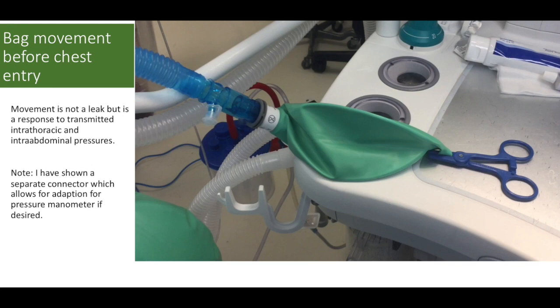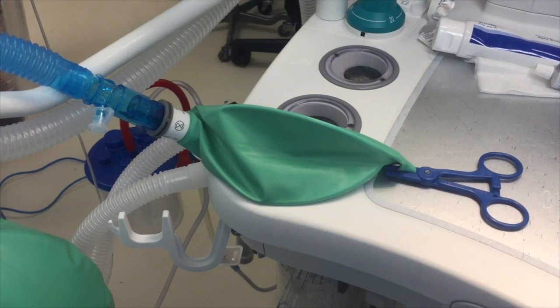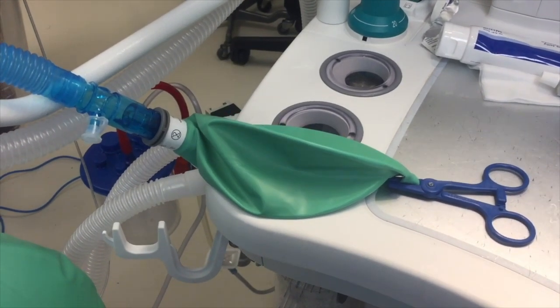In the following clip, we will see indirect ventilation by observing the bag as it inflates and then deflates. The patient is on one-lung ventilation and the chest has not been entered. This indirect ventilation is occurring with 100% oxygen in our circuit. Bear in mind that the dead space in the double lumen tube is quite small.